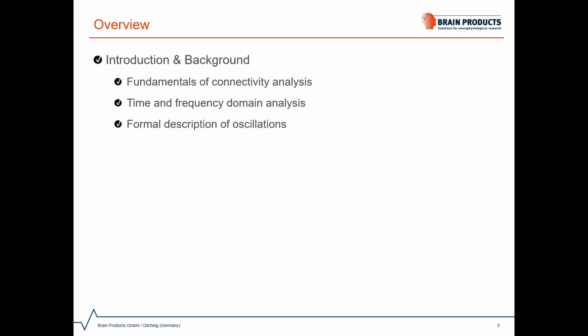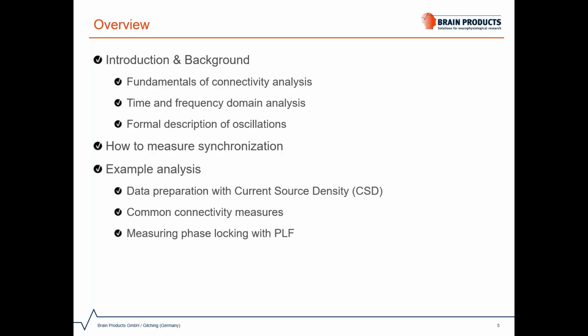I will first introduce fundamental terms and concepts that we need to know about, but also more background knowledge that is important to understand the connectivity methods. I will then focus on the computation of synchrony that is the basis for many connectivity methods, and then we'll go through an example analysis that will show how the methods can be used to explore the connectivity, but also phase locking in our data.